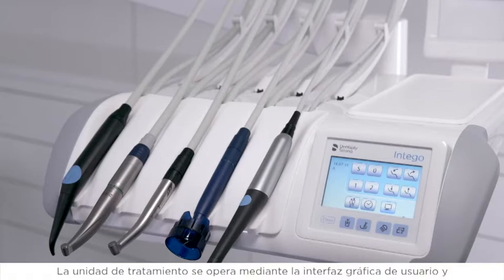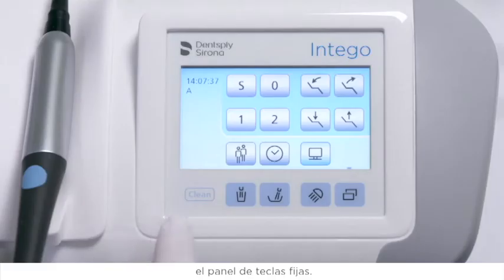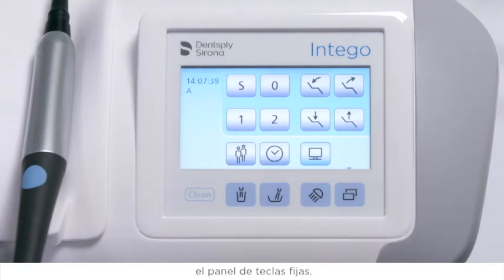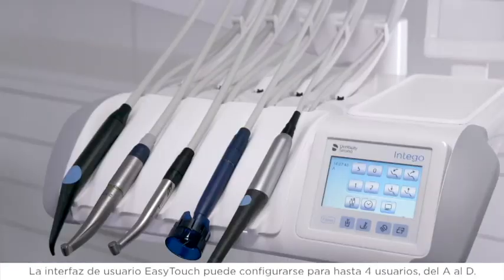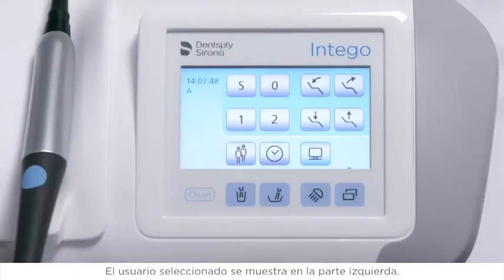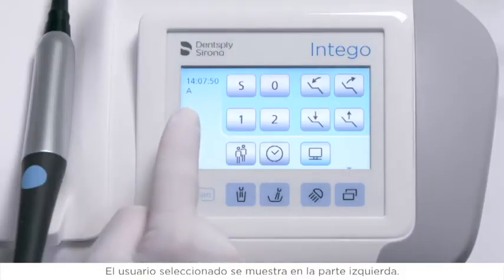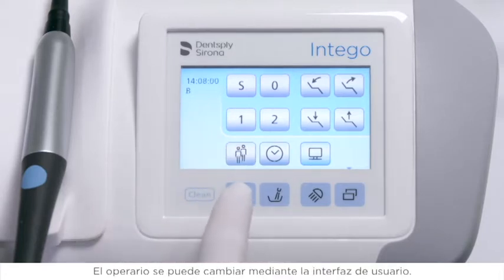The treatment center is operated via the graphical user interface and the fixed key panel. The easy touch user interface can be configured for up to four different users, A to D. The selected user is visualized on the left side, and the operator can be changed via the user interface.